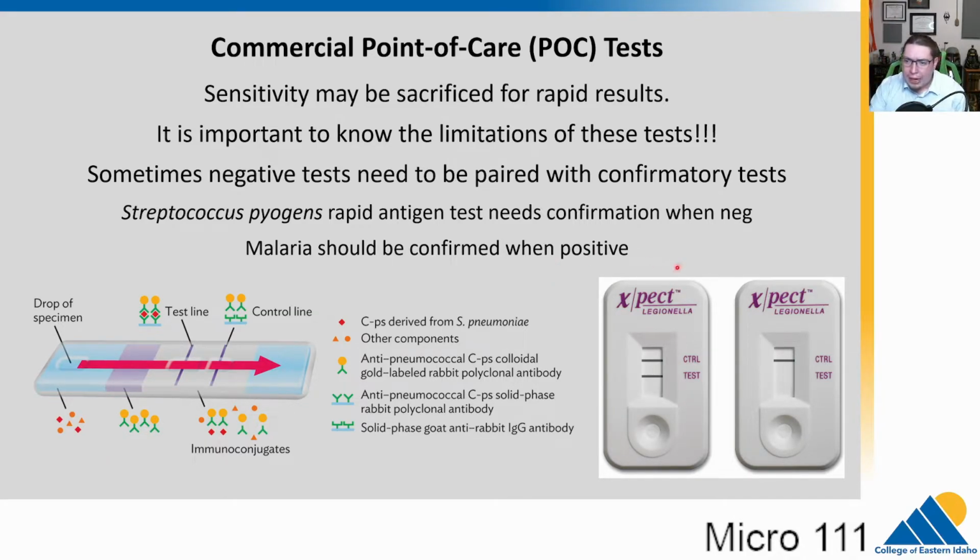So let's look at how these test strips work. These work on principles called chromatography, which means color, but it really means color moving through a piece of paper, basically. And they rely on antibodies. So let me just describe what the test is. Let's take a COVID-19 test, for example. You swab your nose and you put it in a little solution, and then you put some drops of that solution in the little well here. And that liquid is going to run through this test strip.